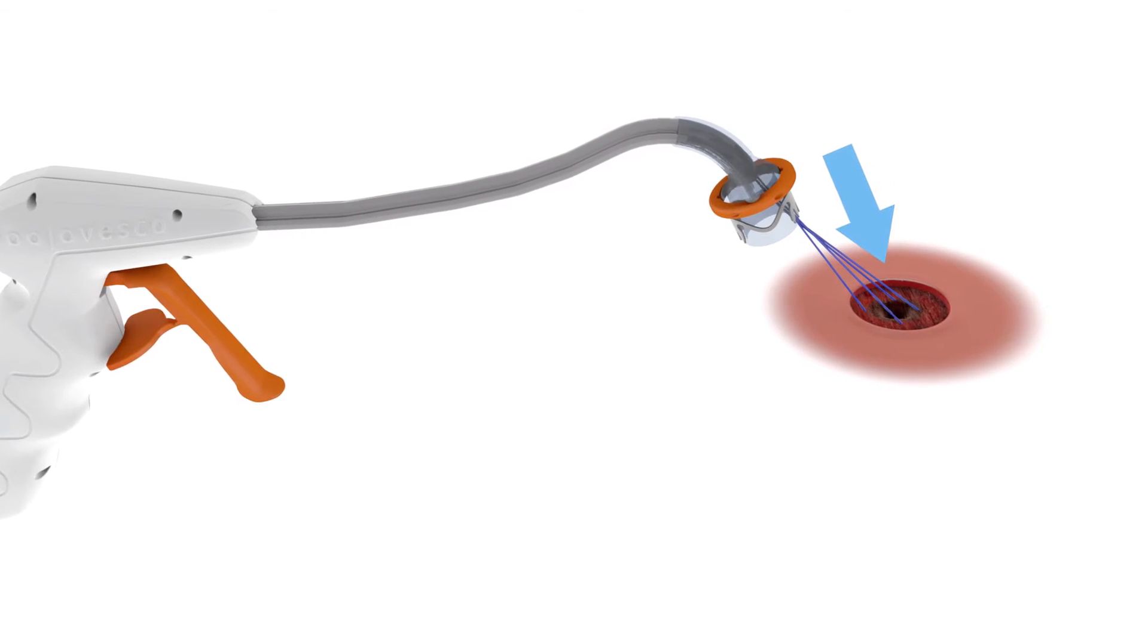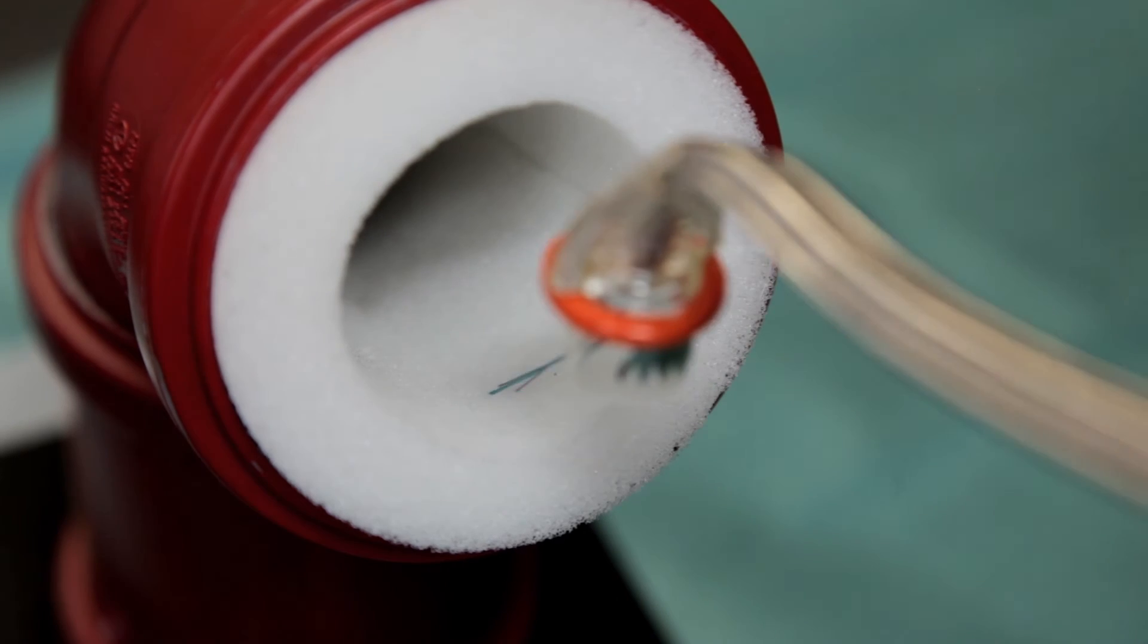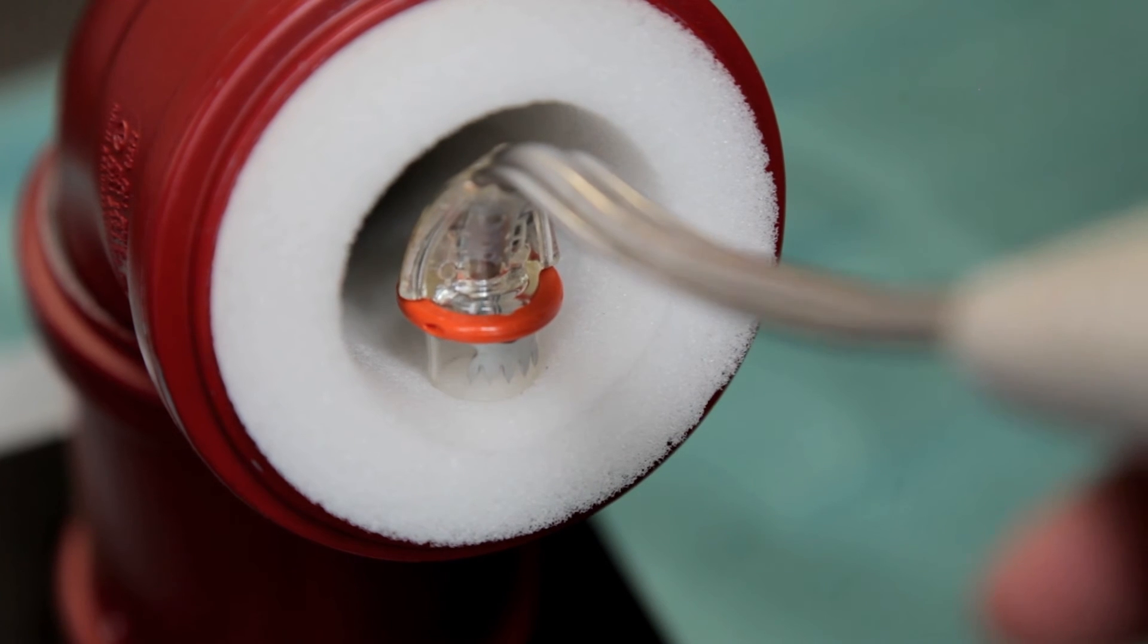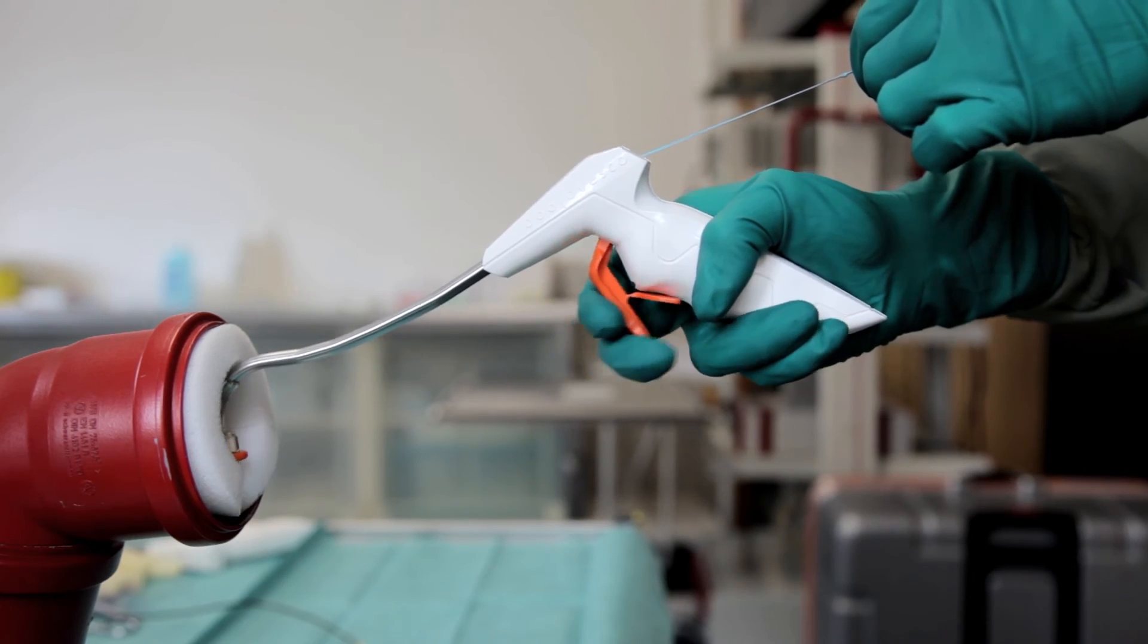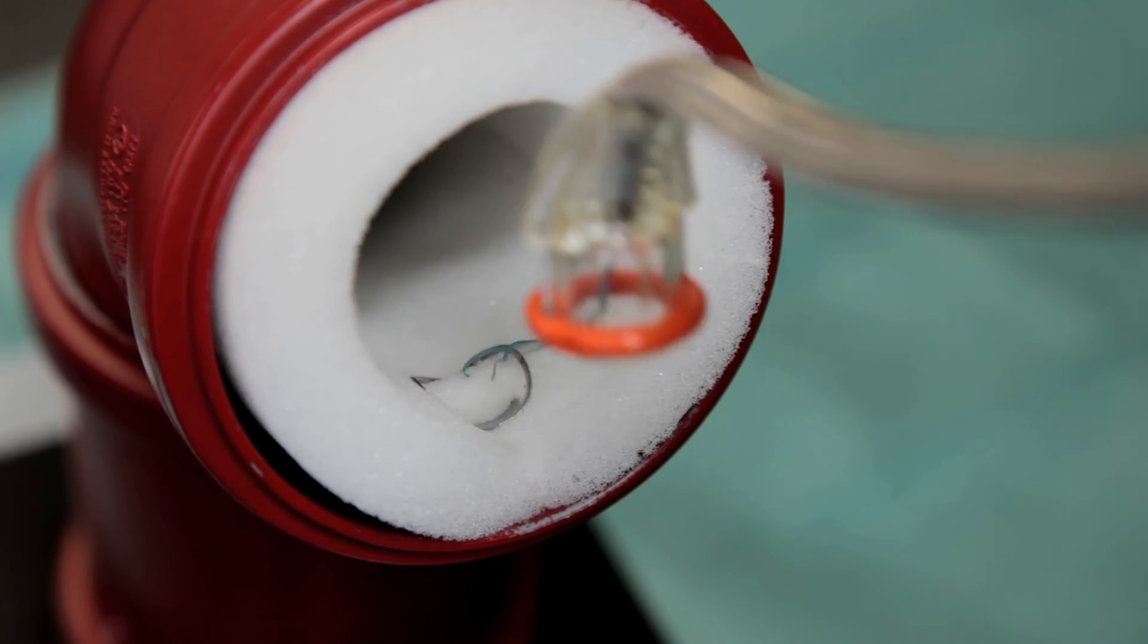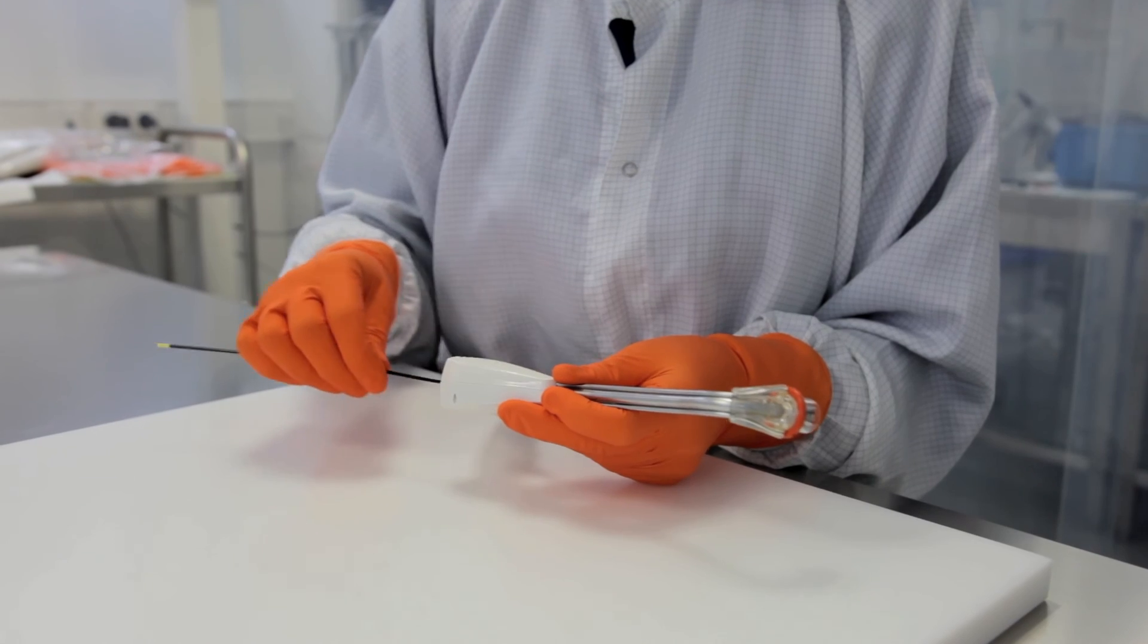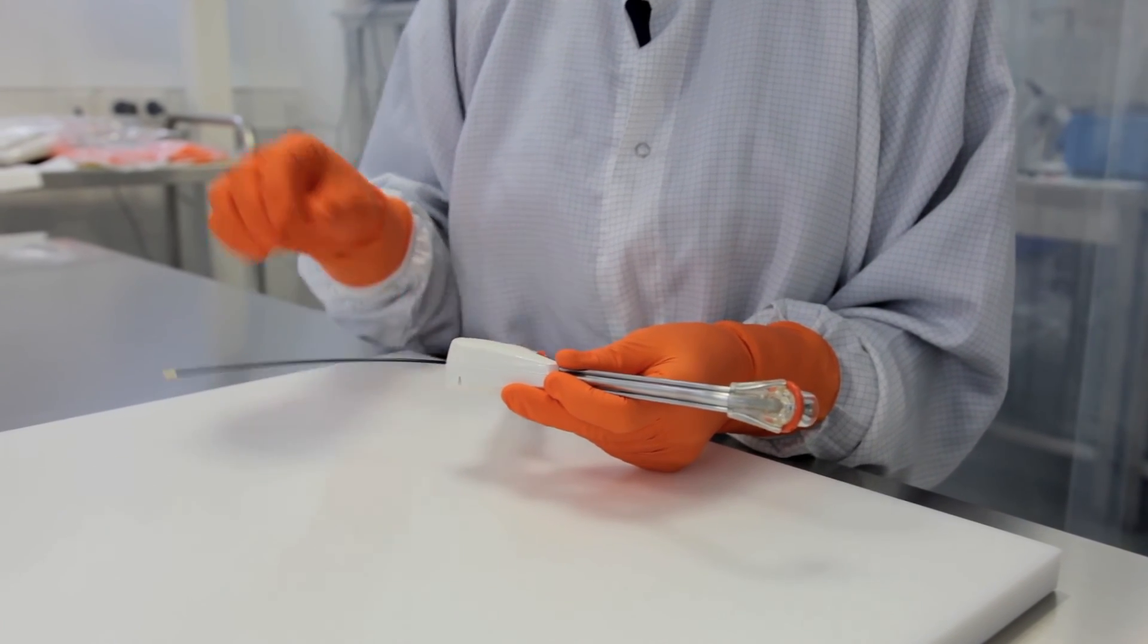Following catheter drainage of the fistula and other initial preparatory steps, the OTSC Proctology Instrument is pushed on guiding sutures to the centre of the fistula and the clip is then applied. This low risk method is particularly suitable for initial treatment of complex anal fistulas and achieves, in the majority of interventions, a complete healing of the fistula.